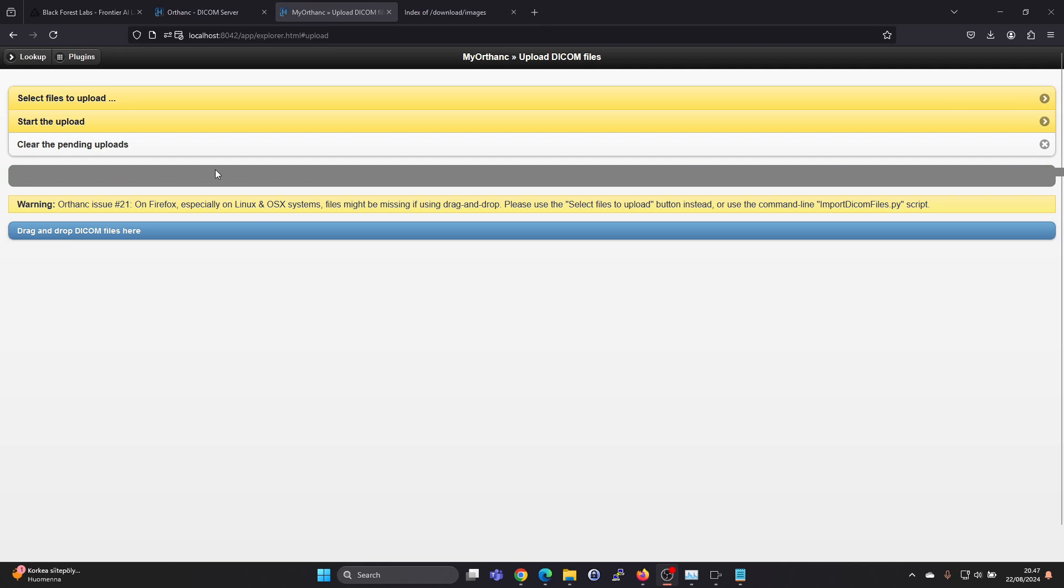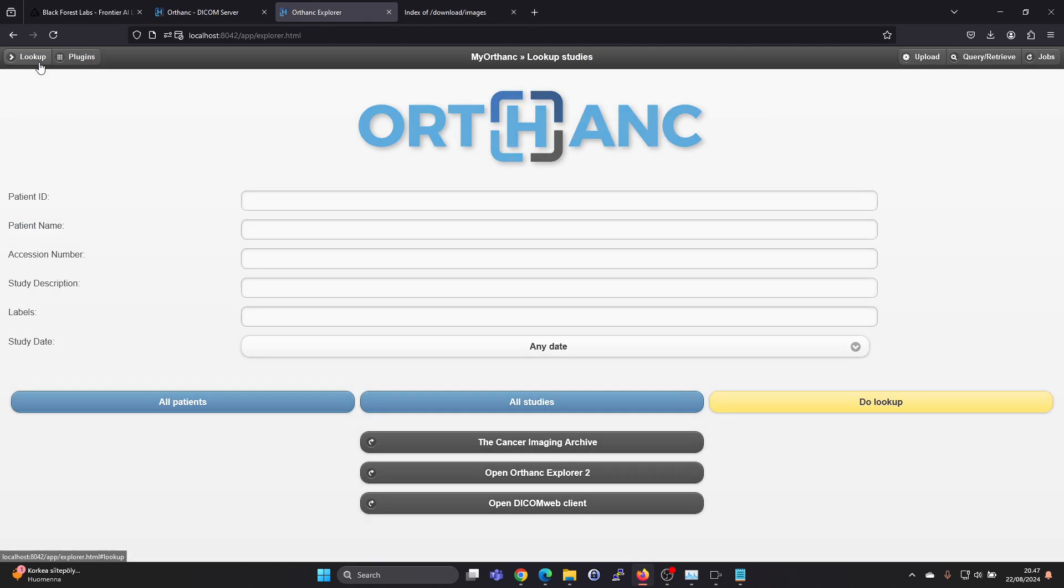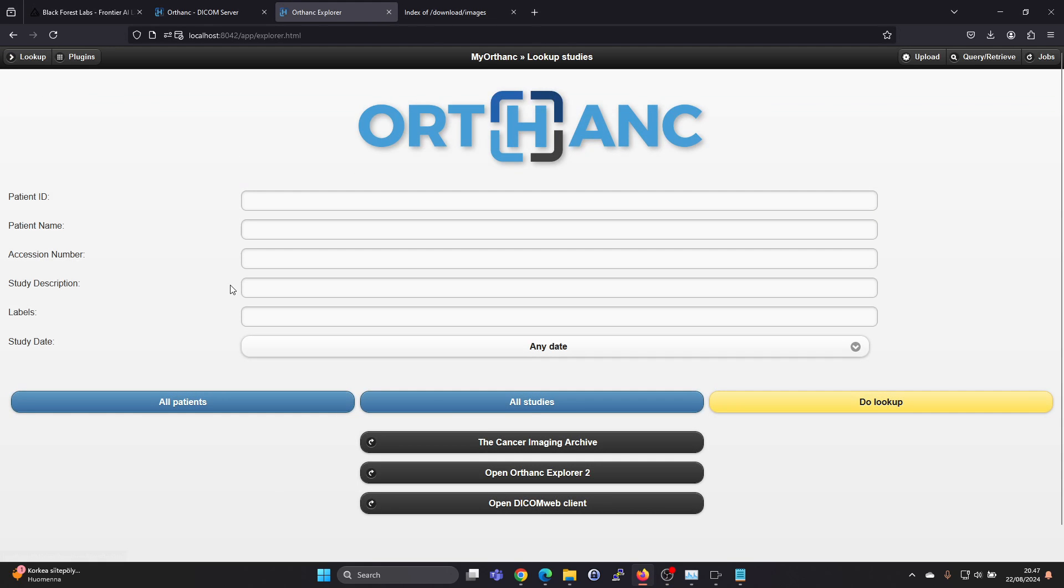And then press on the start upload button. Okay, I think the upload did work. So then just click on lookup.